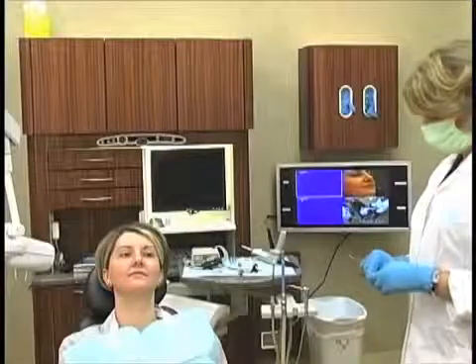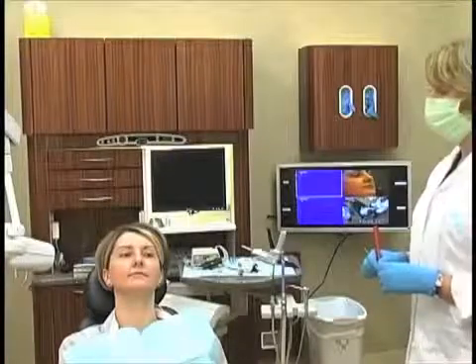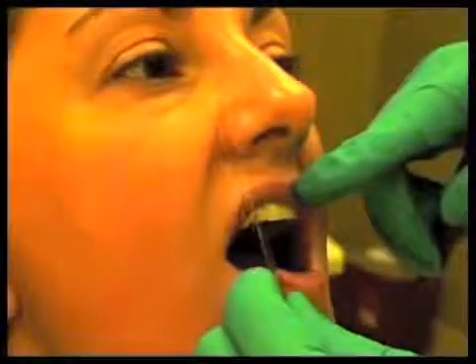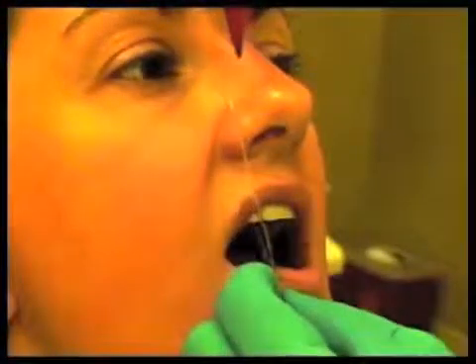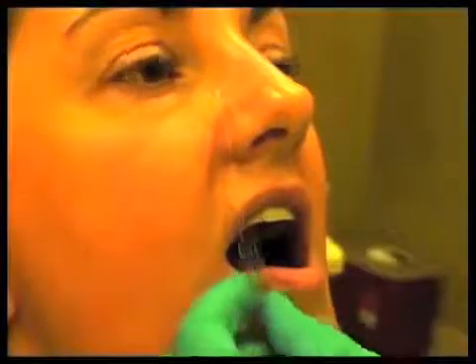Okay, to start this process, we're going to be using something called the reference plane locator, which looks like a little ruler that has one aspect of it that will go on the patient's lateral incisor. And once it's sitting on the lateral, it makes a little point up on the lateral aspect of the right part of her nose. We just take the little marker and make a little dot. And as you'll see, that little dot is going to become important for us to know where the Facebow is going to sit on her face, sort of in the vertical plane.